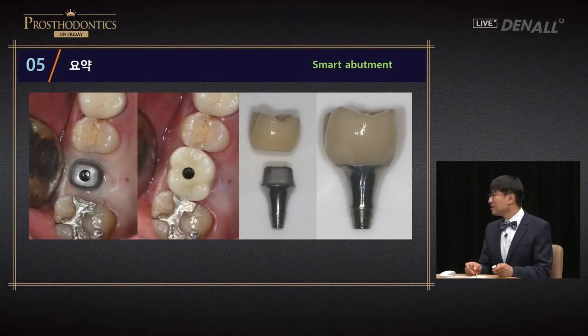This is the summary. In conclusion, I no longer use hex abutment, even in single restorations. The reason is simple. Because the implant itself is non-hex, therefore you cannot use hex abutment. This is not ordinary in single restoration. Hex abutment is more widely used.